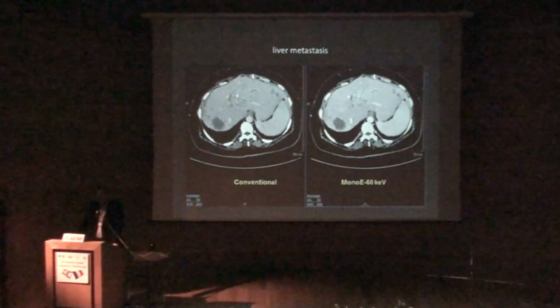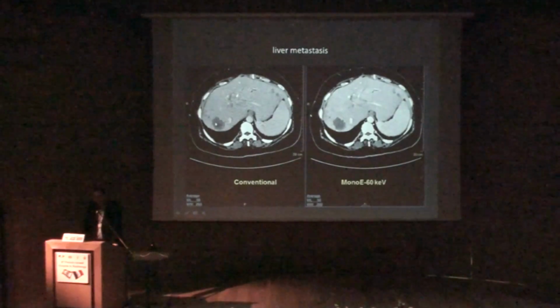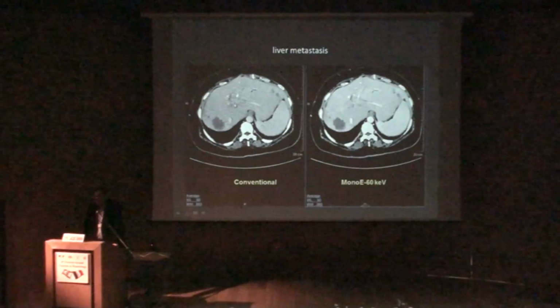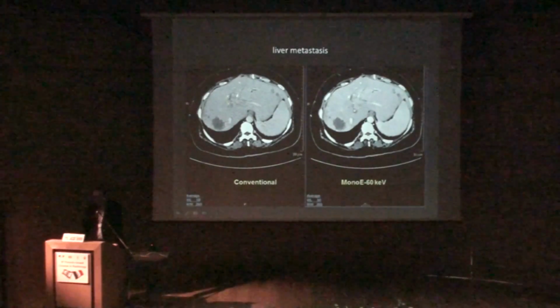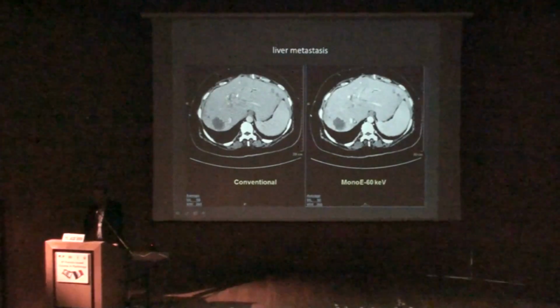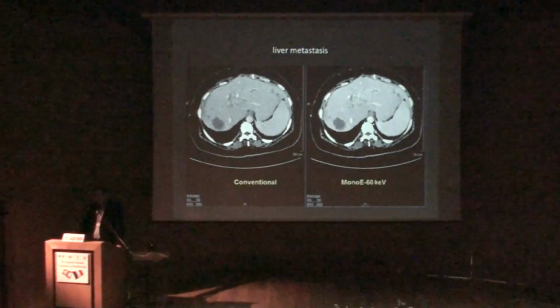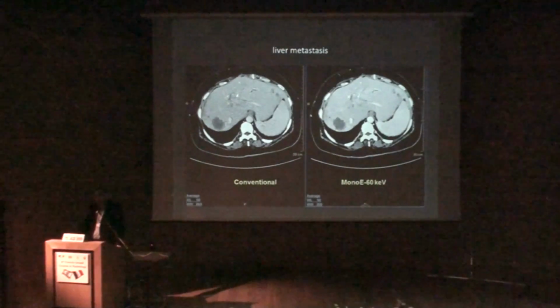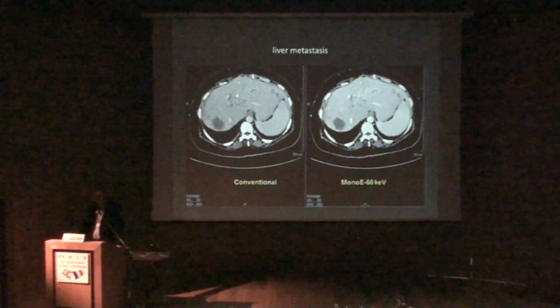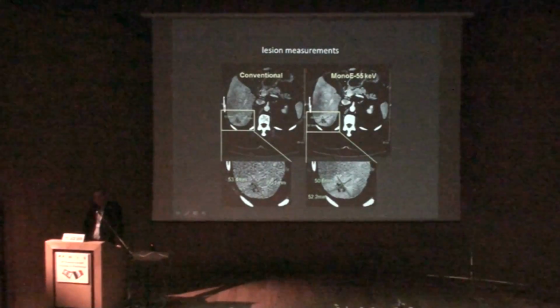If we move to oncology, if we look at the left-hand side, we see a few metastases, one here, and maybe one here, but if you look at the low keV, we can see that there are more. So the question is, now in oncology follow-up, when we evaluate, what keV or what image should we use, and this may be important, and also for the measurements.